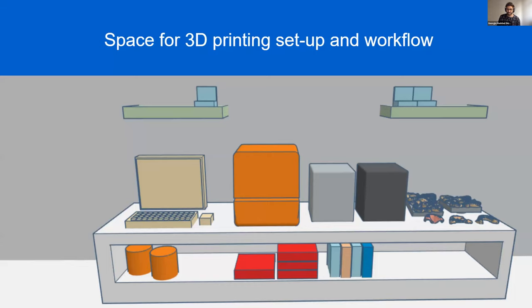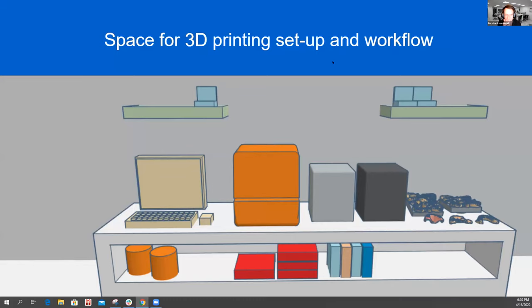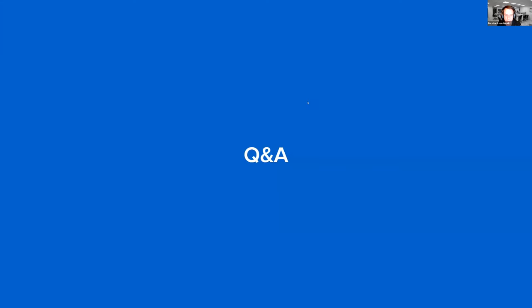So are there any typical questions that we were getting? Yes, I see a lot of questions about hollowing models. From my side, I can tell that this is best done in the cut step, when you actually produce the model in the model builder. But I'm not really sure if this is possible with 3Shape. This is my question to Sune, for example, and about hollowing models with external tools, this would be a topic for Jakob, I think.